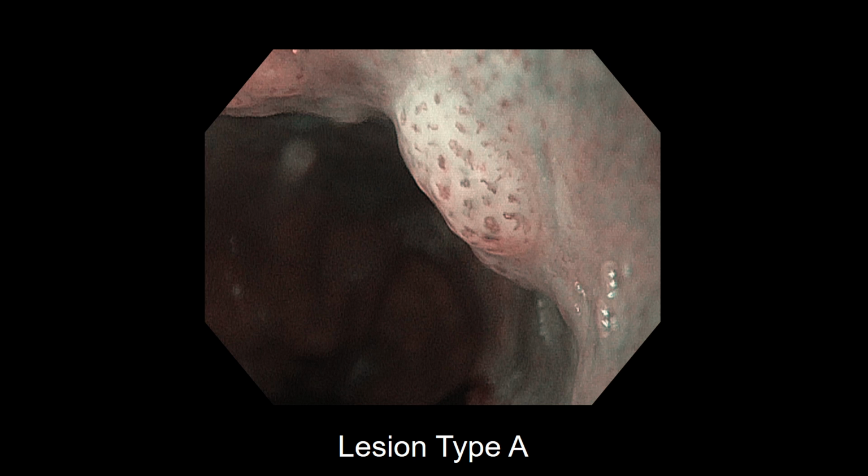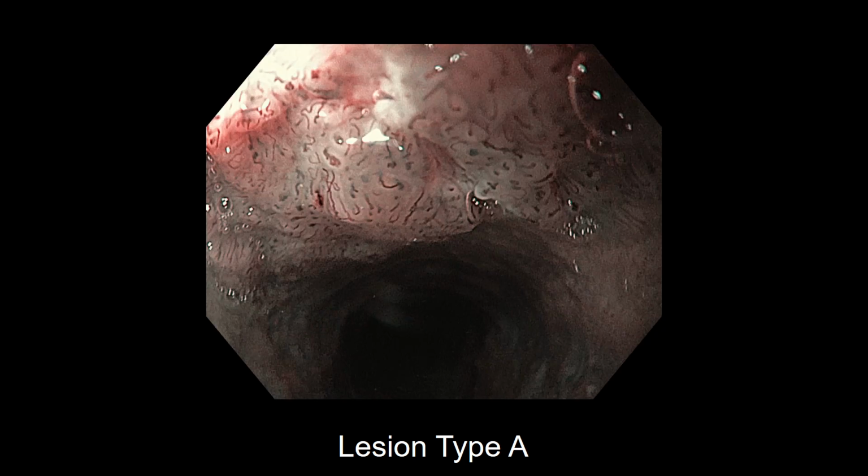In this type A lesion, we can recognize the IPCL very well. It's already irregularly arranged, but still keeps a loop of its original shape. So this is a mucosal lesion. And the protrusion is made by upward growth of the tumor, not a downward growth. So this is mucosal. Okay, let's go to the next area.